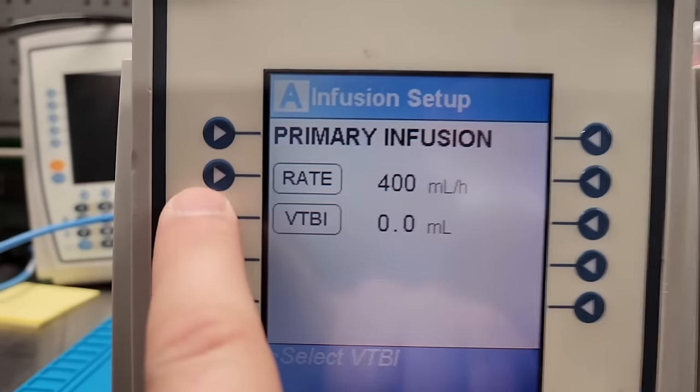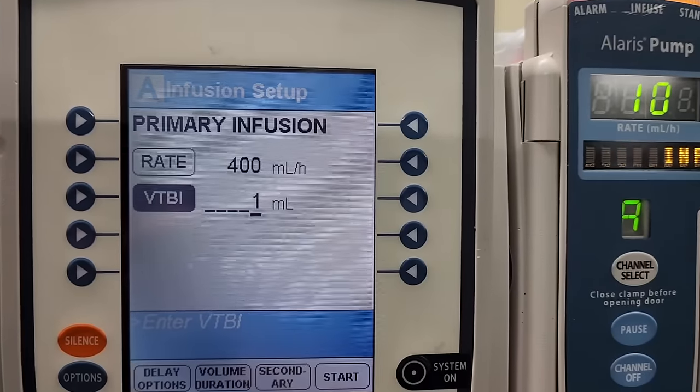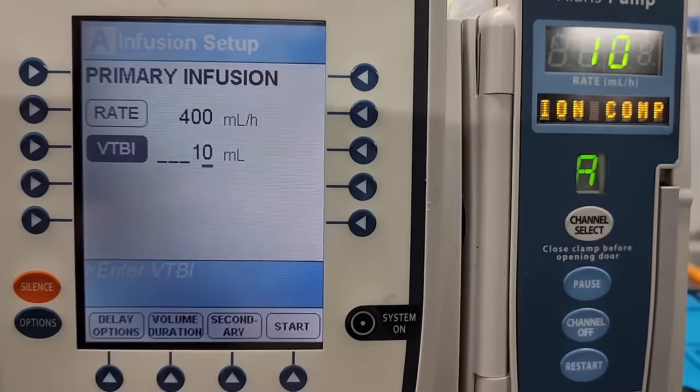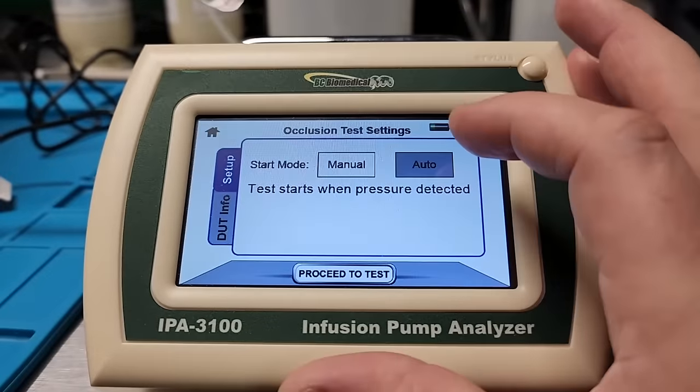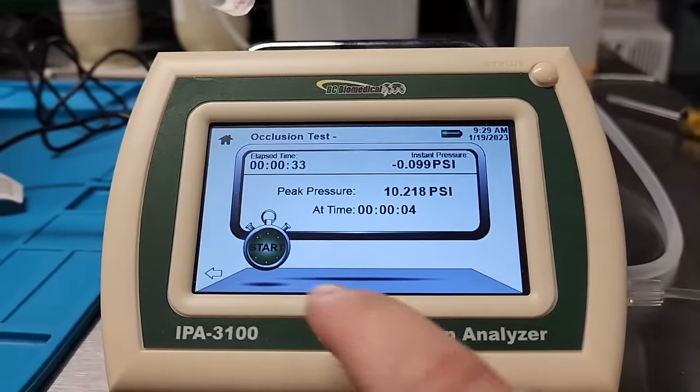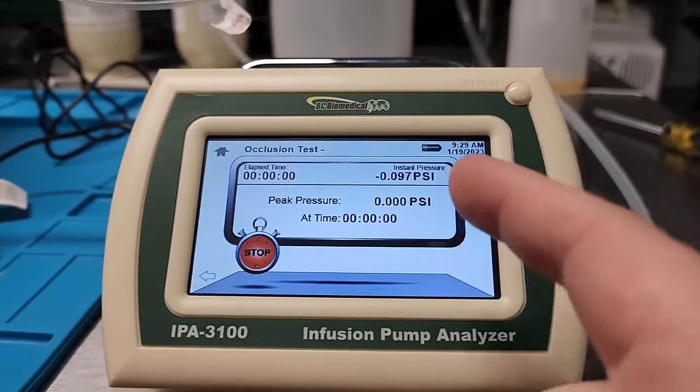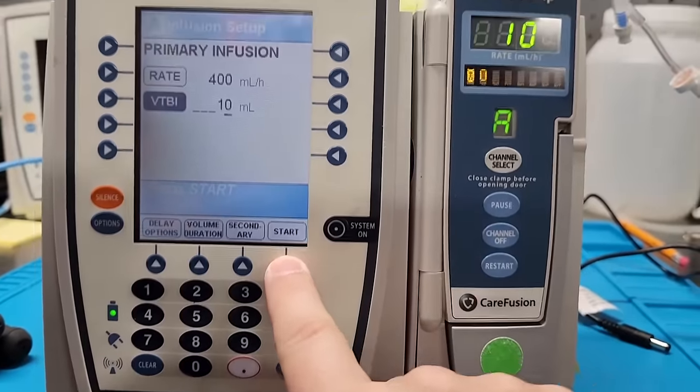And I'm going to do an occlusion test. So let's go ahead and set this guy for, let's say 10 milliliters. And let's come back here. Occlusion test. Proceed to test. It says it's going to be automatic. So it reset everything. And let's do a start.